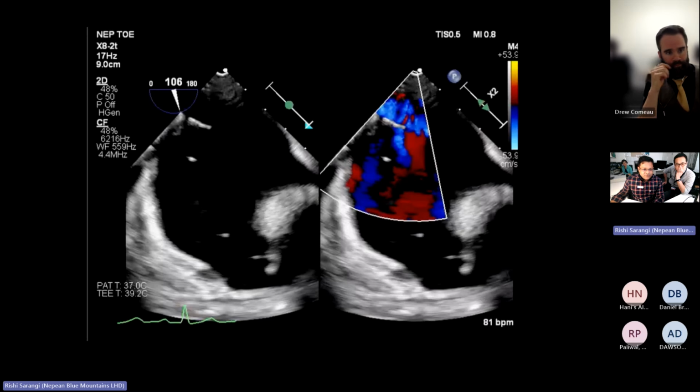So which one is SVC? Which one is IVC? So this one is coming in as SVC. This is IVC coming at 10 o'clock position. Yeah. This is the interatrial septum. This is the right atrium. So what is the structure at the tip, where the IVC joins the RA? So that's just prominent, like a eustachian valve, is it?